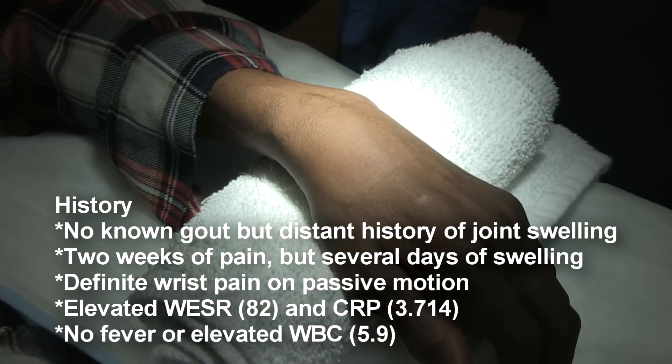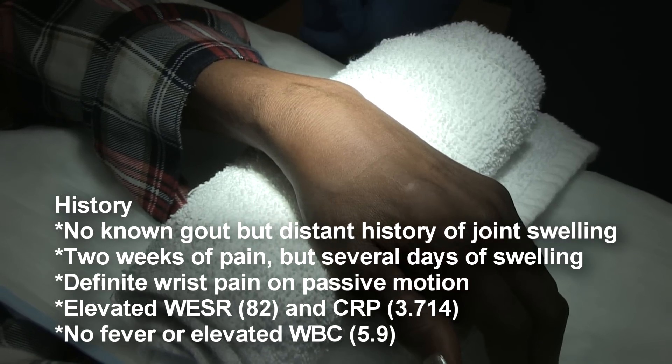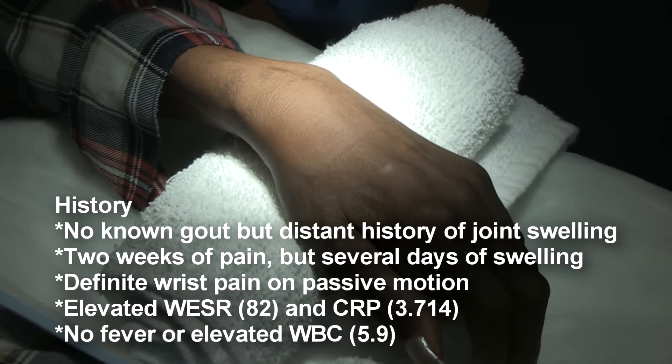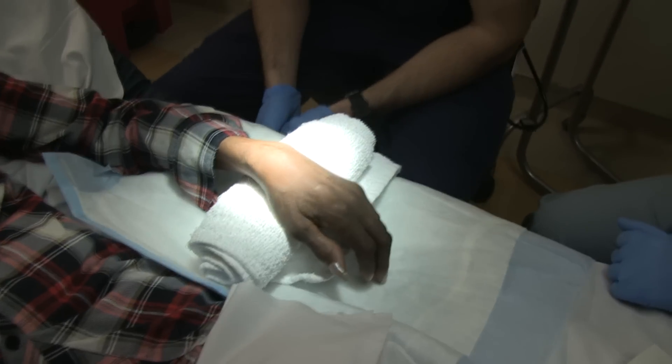We're going to do a procedure today — a wrist joint aspiration. This young lady has agreed to let us put this on a YouTube video. She said, 'All right, go for it.'